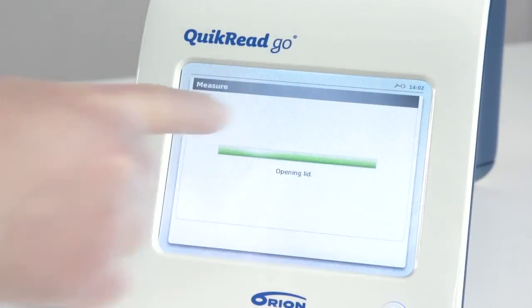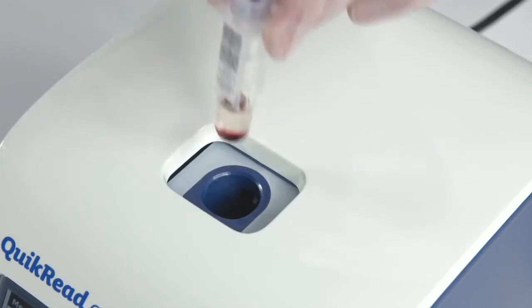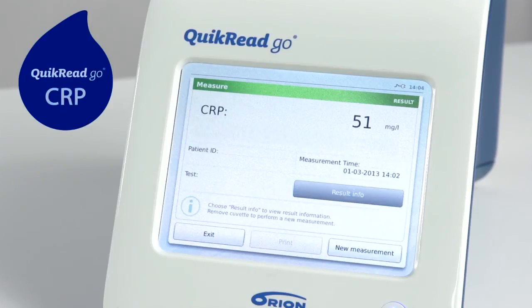Choose the measurement from the display of the Quick Read Go instrument and follow the instrument screen for instructions. When the instrument guides you, insert the cuvette into the measurement well. The instrument starts measuring the sample and you can follow from the screen how the measurement is proceeding. The test in use is also shown on the screen. When the measurement is completed, the results appear on the screen and are automatically stored in the instrument memory.